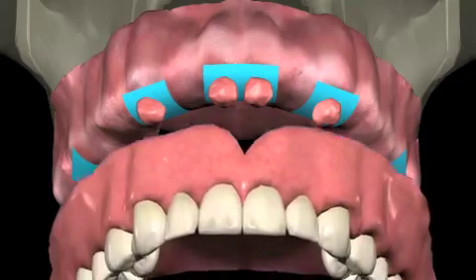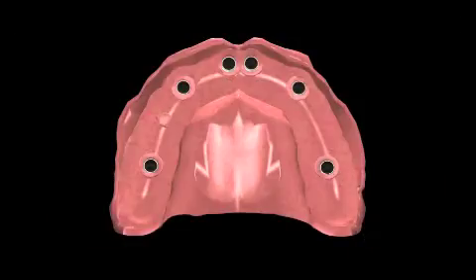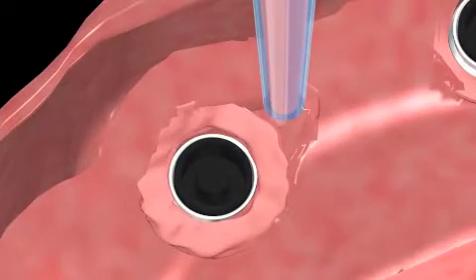Passively seat the overdenture, ensuring that the tissue is not displaced. Fill any defects with resin.